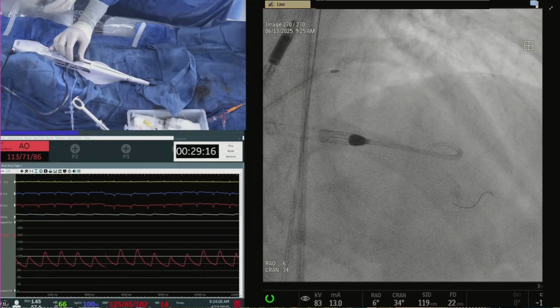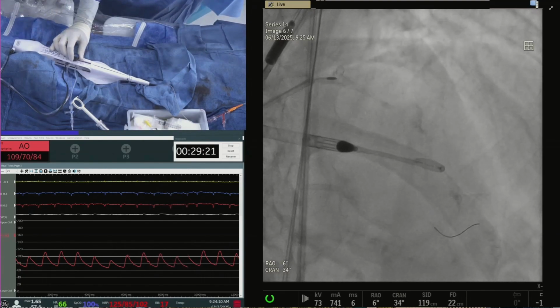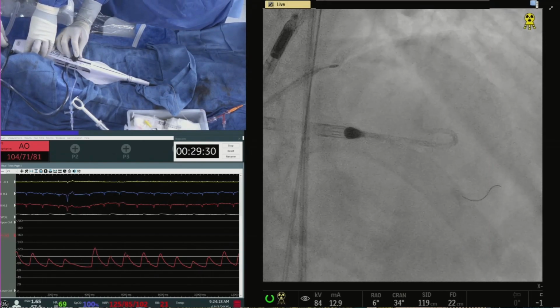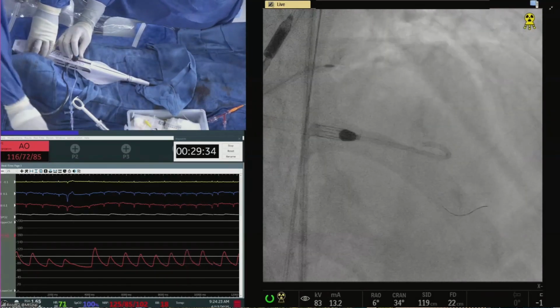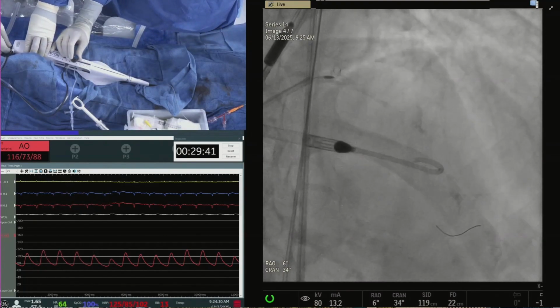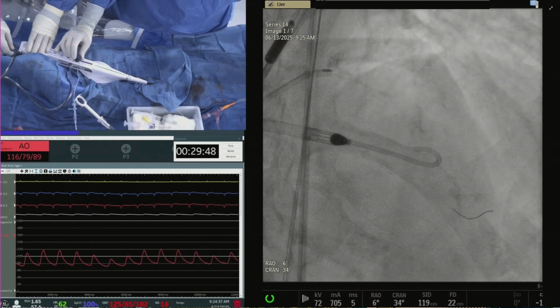Yeah, let's see, Dr. Kinney. I know that she's worried about that takeoff into that diagonal, and maybe is going slowly. The heart rate has picked up a little bit, I think. Anu, do you want to tell us what's happening there? Yeah, so we took a 1.25 burr just because of the diagonal takeoff, and I just did a dry cine. You see that? Just want to see if there is any kind of wire bias. There is some wire bias, so we just have to be very cautious and gentle. The entire case is doing rotational atherectomy into that diagonal.